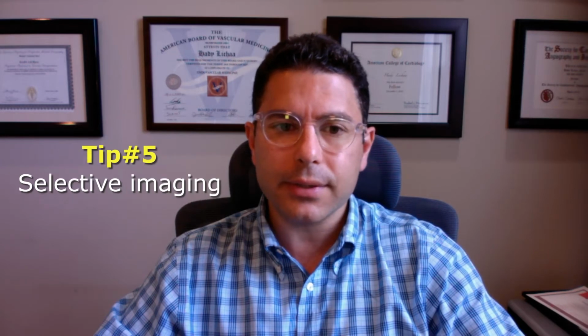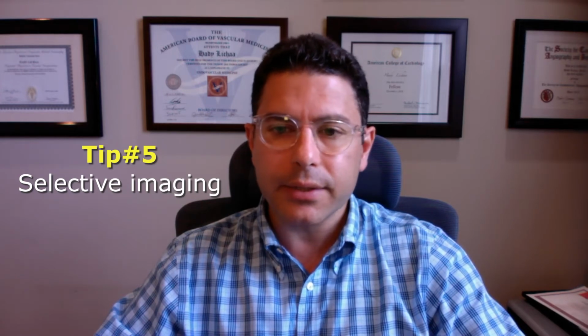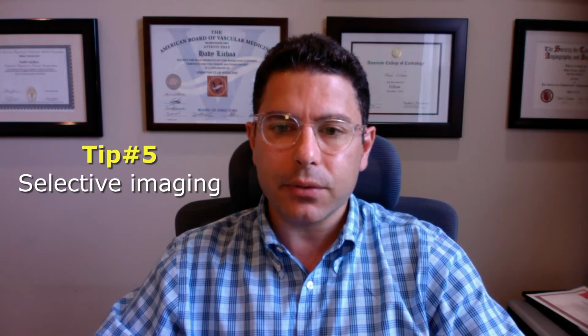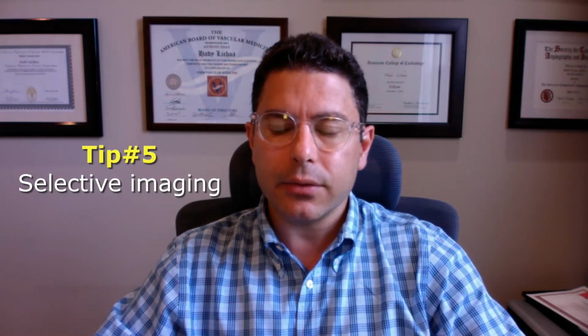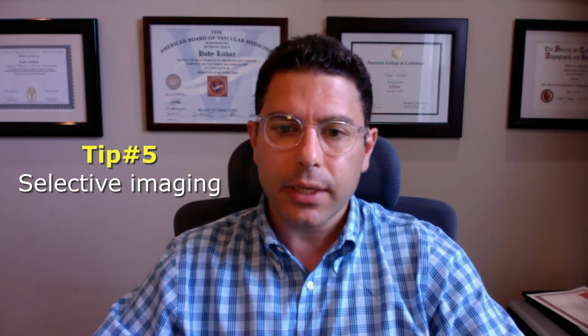Number 5, selective imaging is very important with CO2. So getting an abdominal aortogram to look at the SFA is not the best idea. So obviously get selective into the vessel you want to image and use an end-hole small catheter. And this applies specifically to the infrapopliteal vessels.